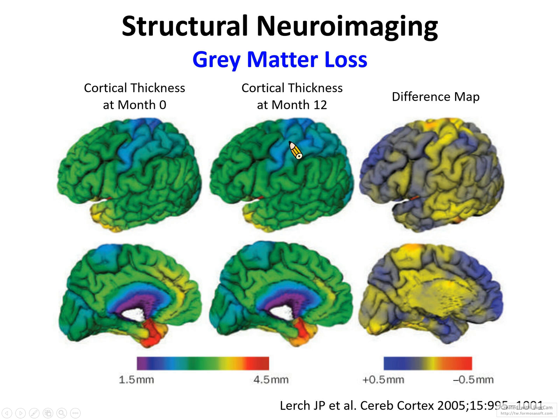Maybe your eyes are more sensitive than mine, but I cannot see any difference if you just show me the cortical thickness by colors. But if you subtract these two maps and put them in an appropriate scale, you can see there is really a decline in cortical thickness even only 1 year after the diagnosis.